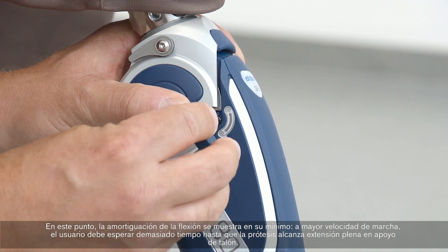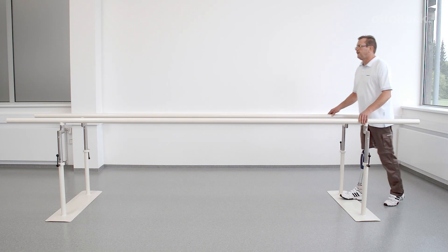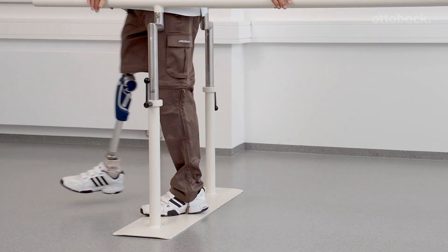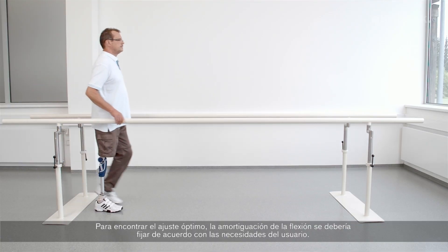At higher walking speeds, the user has to wait too long for the prosthesis to reach full extension at heel strike. In order to achieve an optimal setting, the flexion damping should be adjusted according to the user's needs.